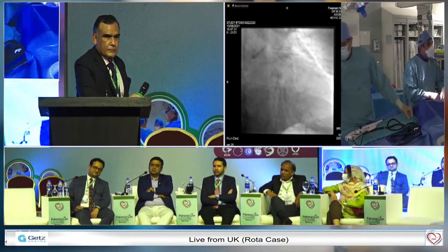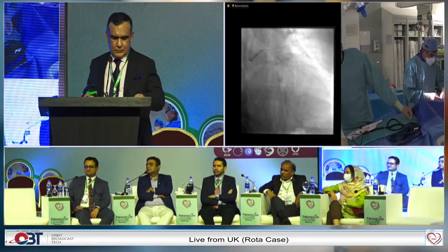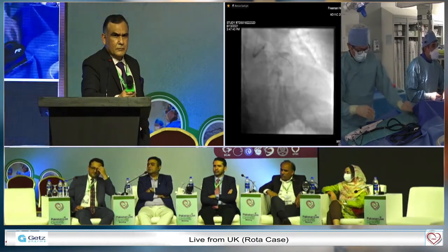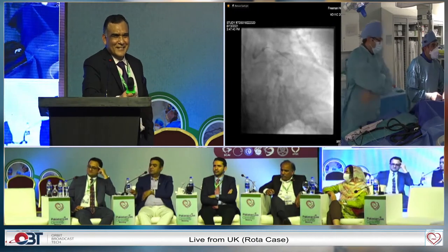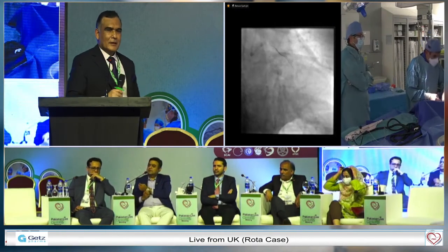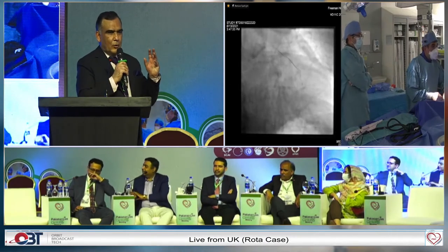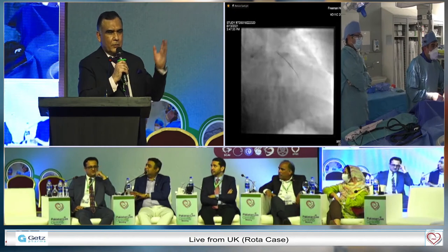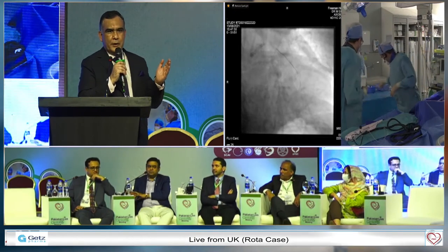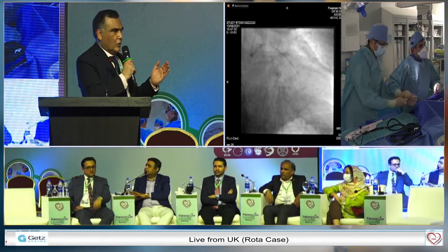But the differential cutting, you can do, and maybe in your hands, but it's not the traditional teaching, and it should not be done as a routine, because most of the time nothing happens, but if something happens, then you will be in trouble. Which one should not be done as a routine? I think the argument is that yesterday the gentleman went with 20 atmospheres on a cutting balloon. Every day we are going above rated burst. So there are various things that we do which are not really guidelines.